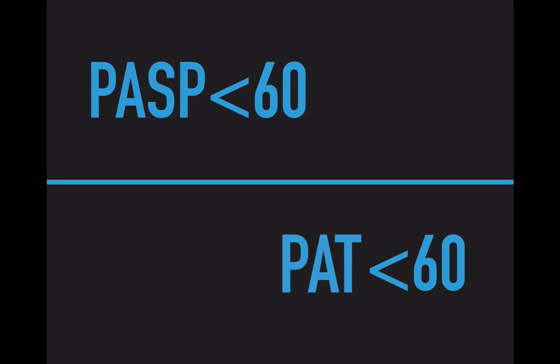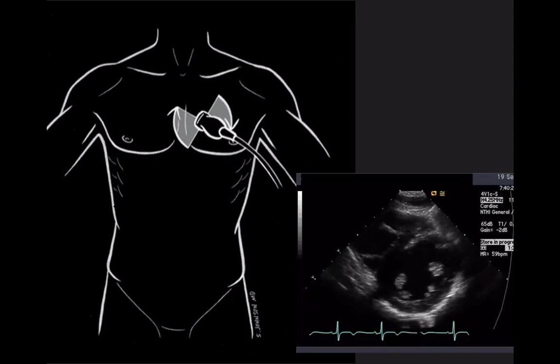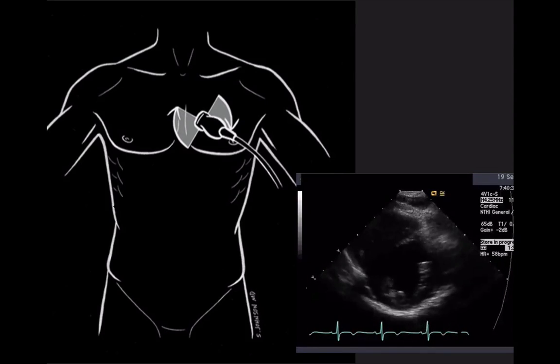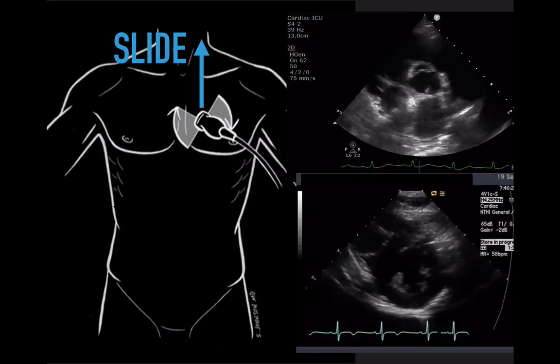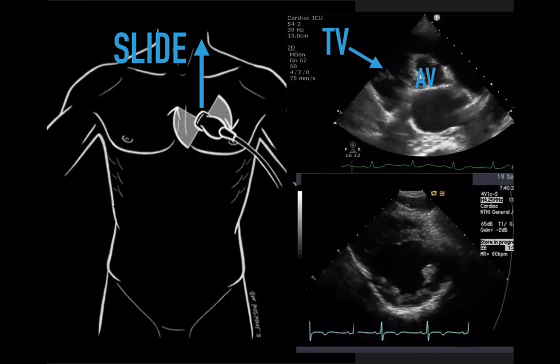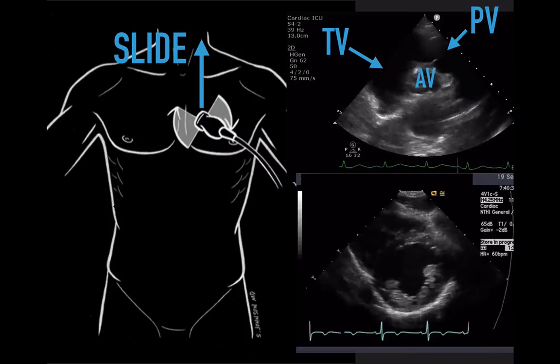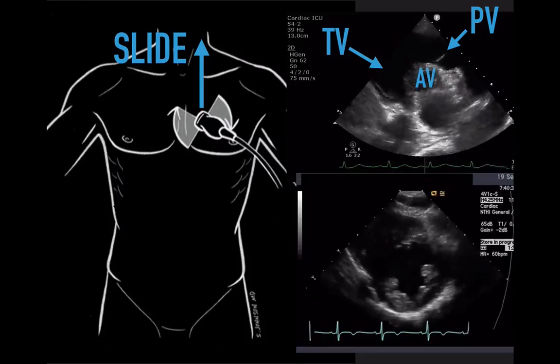The other half is pulmonary acceleration time less than 60 milliseconds. Here's how you measure that. Everyone is used to getting the parasternal short axis view at the basal papillaries — a nice donut-looking LV. But if you slide up a little bit on the chest with the probe, you end up with a view showing the Mercedes-Benz sign, the aortic valve, the tricuspid valve, and importantly the pulmonary valve. As you have the right ventricular outflow tract going over, you can measure a velocity through there and measure your pulmonary acceleration time.